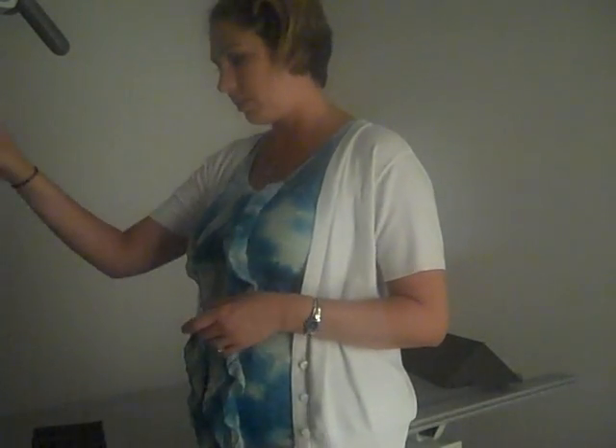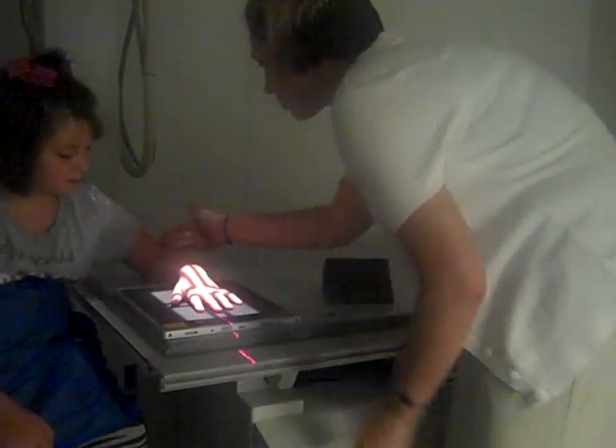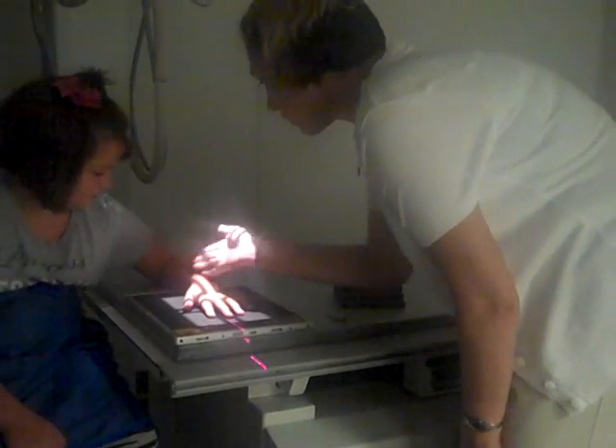The next view in the hand routine is the oblique. You can leave your film and your light set up pretty much the same spot. We're just going to have our patient bring their arm over again, elbow on the table, making sure that we've got the 90-degree angle between the upper arm and the forearm.